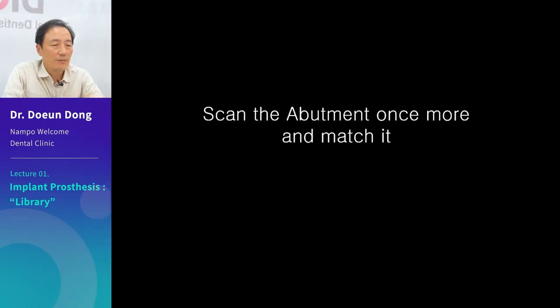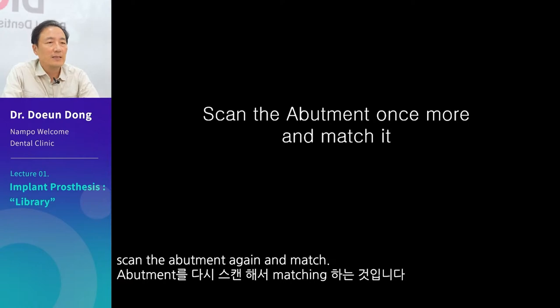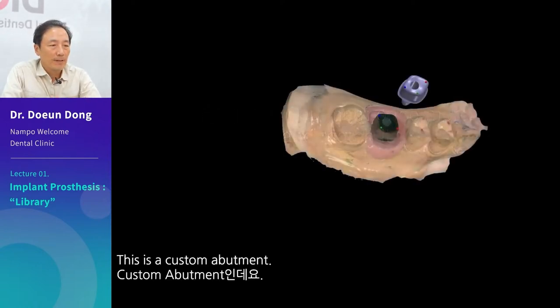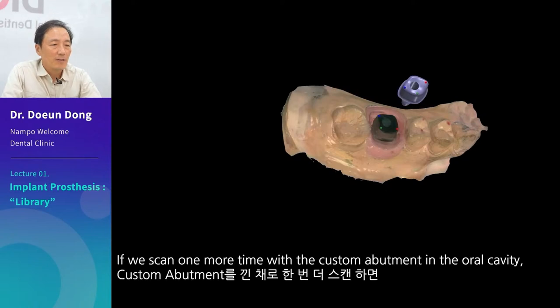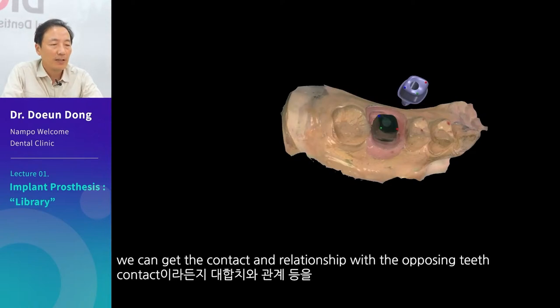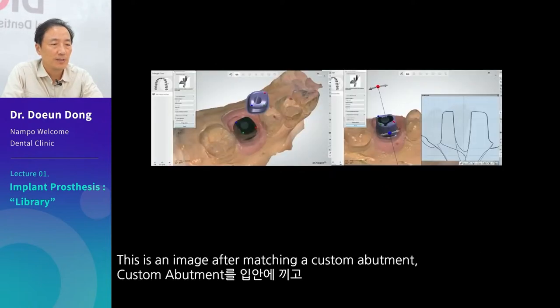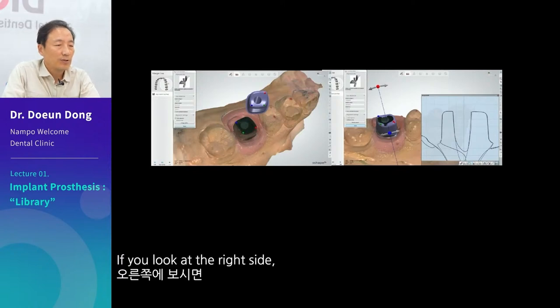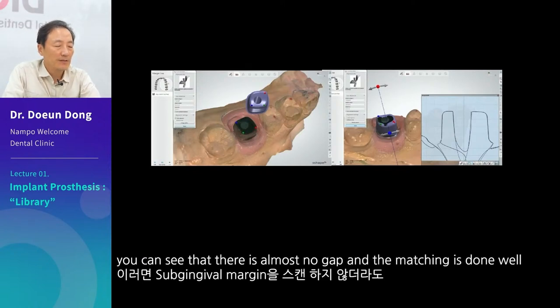To make merging easy, scan the abutment again and match. This is a custom abutment. If we scan one more time with the custom abutment in the oral cavity, we can get the contact and relationship with the opposing teeth with much more precision. This is a cross-sectional drawing — you can see that there is almost no gap and the matching is done well.